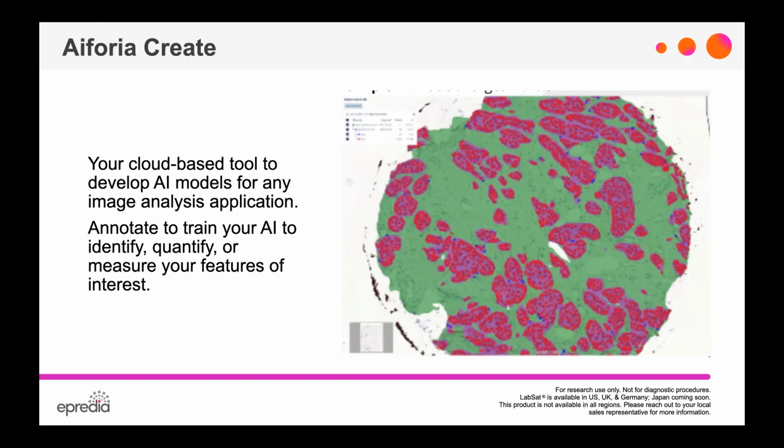And within that, I'm able to also check out different variations of those cells, very specific patterns of those cells, depending upon what disease state I'm looking for, whether it's going to be cribriform or sheets or various different patterns in those tumor cells. And as I add those layers, it adds to the quantification output that I'm able to do. So you can start simple and build on the complexity as your research grows in that particular set of slides.